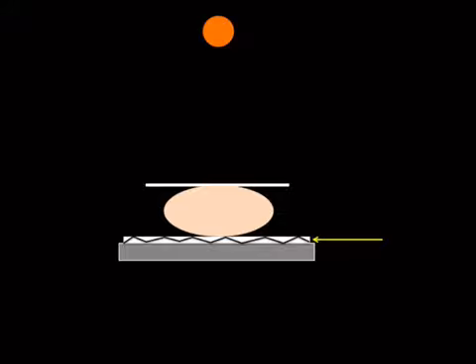you can't use the same technique that you would use without a grid. Otherwise, you'd end up with underexposure. So ultimately, you have to turn the technique up, and that leads to an increased dose as a result of the grid, which is something that we talked about before. So the grid initially reduces the dose, but that would create a non-diagnostic image, so you eventually have to increase the dose. So bottom line, for the purpose of multiple choice, a grid increases the dose.